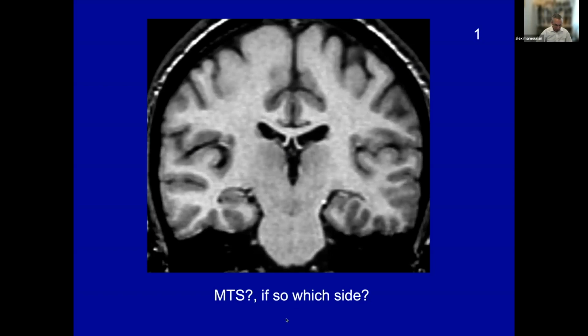go to, let's see if I can pull this up. Okay, now I want you to look at this image.